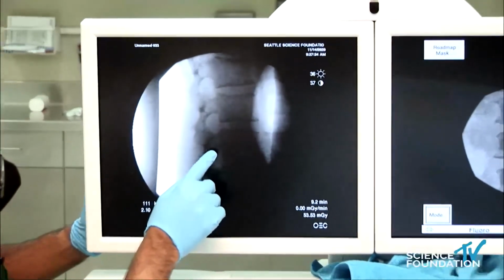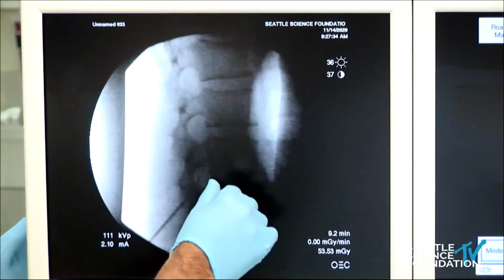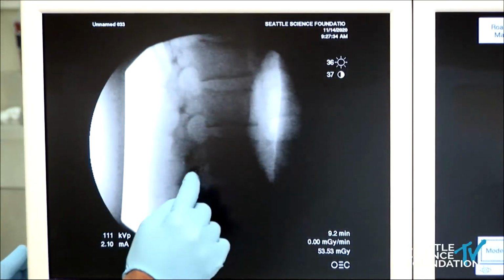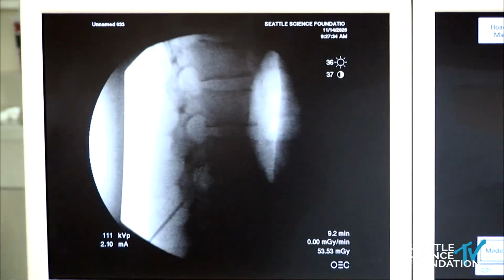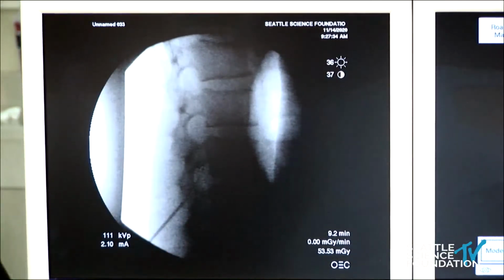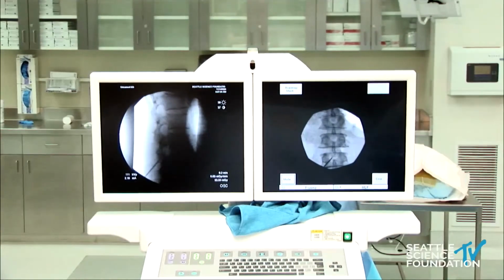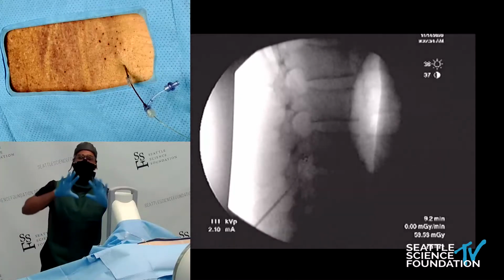So you can see the 4 contacts here. What you wanna make sure is that those contacts do not cross the posterior border of the vertebral body. Here you can see the foramen. The DRG is really sitting high and tight in that foramen, so this is perfect. This is golden. This is exactly what we wanna see. Those electrodes are also radiolucent in the middle, so sometimes you'll see a Cheerio, and that's a good sign as well, because that means that electrode is shooting right out at you. So this looks perfect from a lateral view.